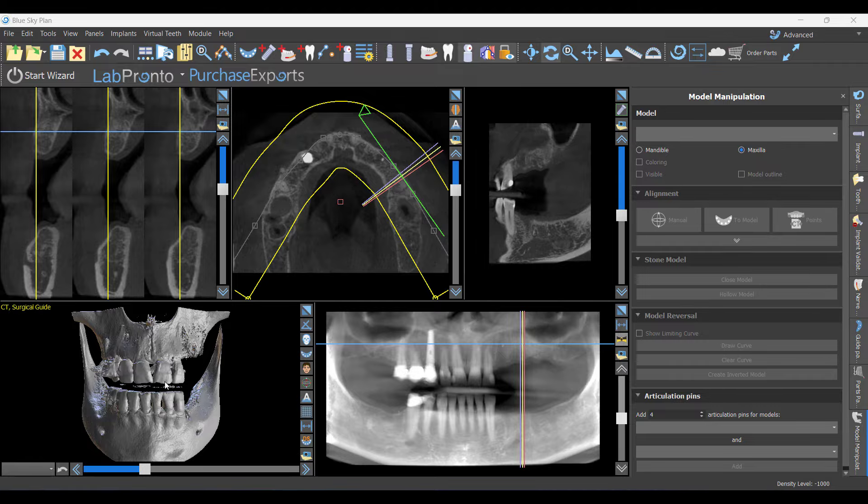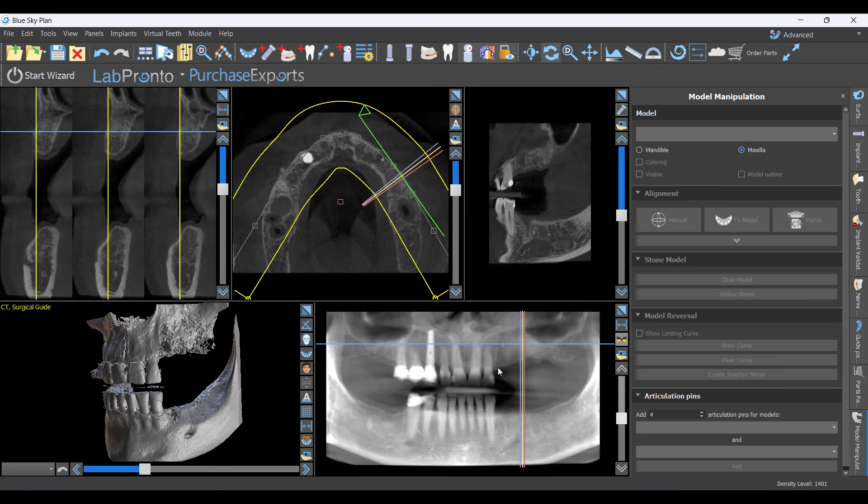We're going to do this case — a patient missing a bunch of teeth. It's going to be a distal extension guide for placing implants. This video is broken into a couple of sections: the first is doing the wax-up, which is what we're focused on here, and the second video will cover making the guides, because distal extension guides present a unique set of problems.